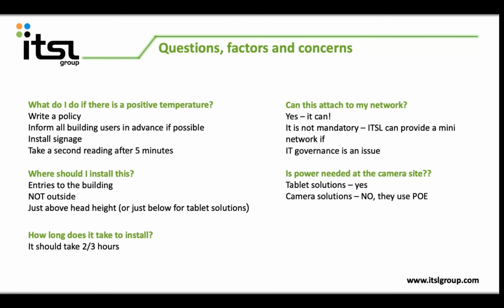I'll quickly run on to the installation timings, just because that works with that last question. Around 2 to 3 hours. It is obviously dependent on your environment. So if we need to do so, we will do a site survey. But obviously your individual environment will determine the timescales for access, height restrictions, physical wall structures. Can we run the cables in the wall, outside of the wall? But for the small camera, the tablet camera, that's a much quicker installation. That's a case of building the required stand. Typically can be done within an hour. So quite a simple setup.